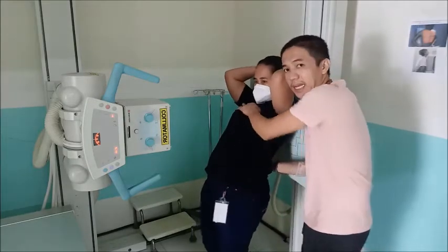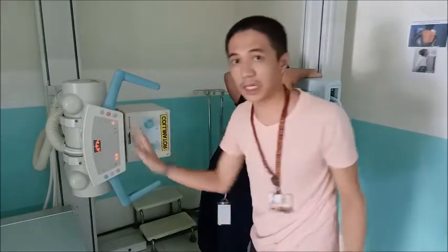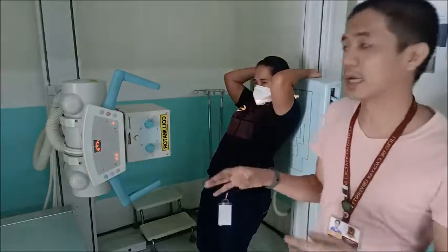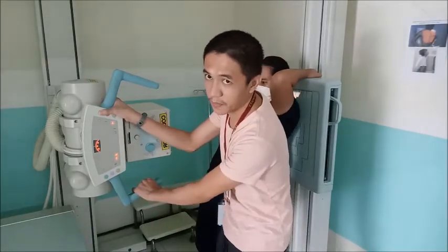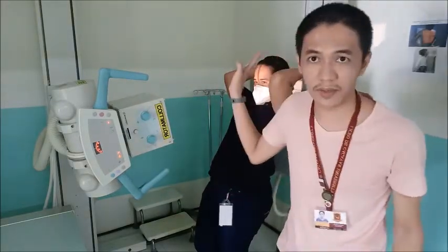So kung dili kayo makabiad atong mga patient, forward. Kung dili kayo mo makuha ang apicolordotic nga view for a certain type of patient, kasi dili kayo sa makabiad, then katong naa sa yung positioning book by the theory, you can angulate the central ray sa palate, no, towards the head of the patient.